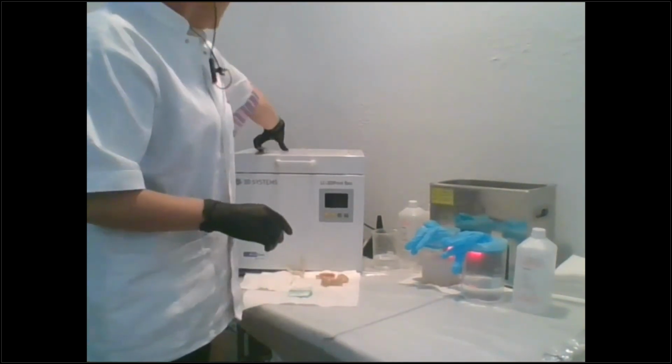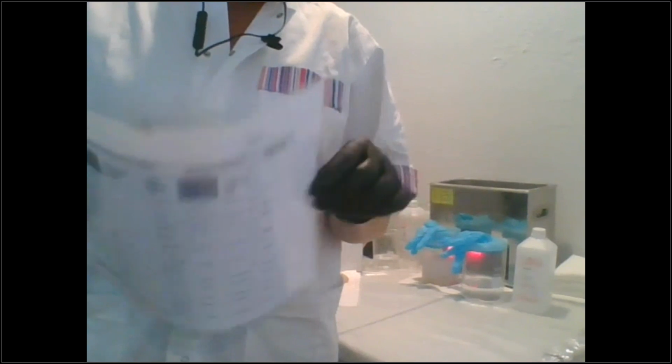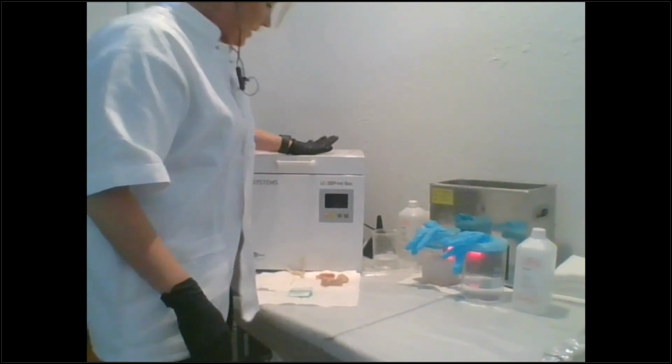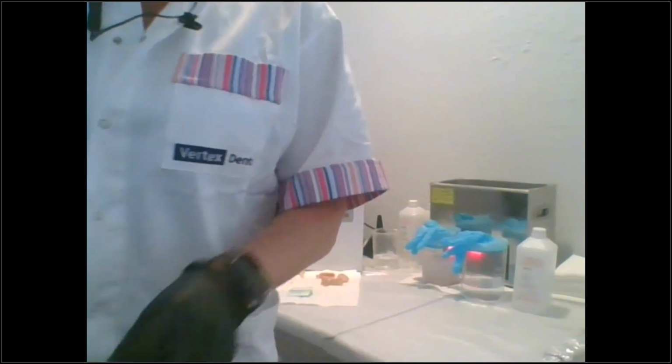So once you do that, you should have your little cheat sheet that we have online. It's your stirring and mixing chart. So I laminated mine, and I just keep it taped up here, and now I can wipe it down if I need to, but it tells me exactly how long. I don't have techs guessing, and I'm not guessing. So you'll just put it in there for the 10 minutes, and then you'll have your lab analogs done.